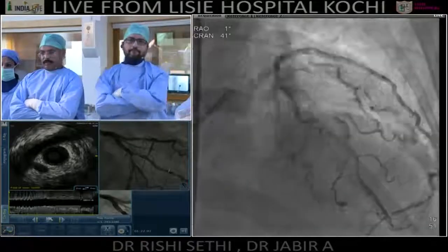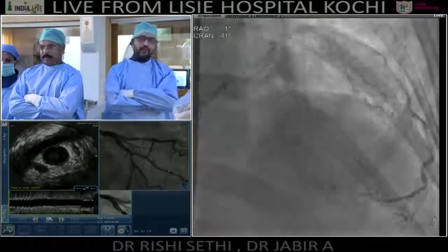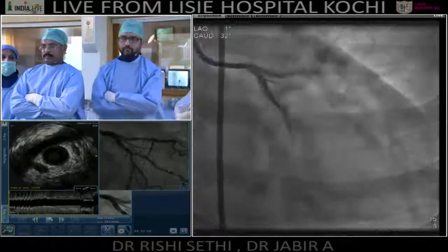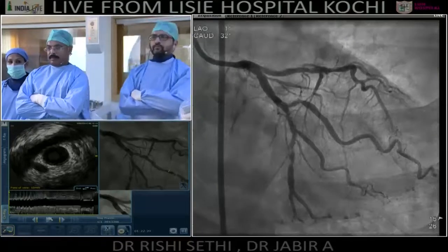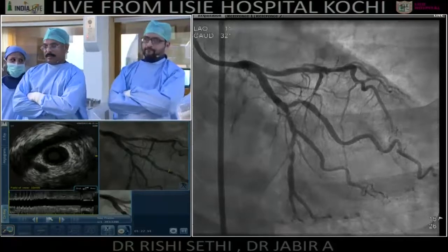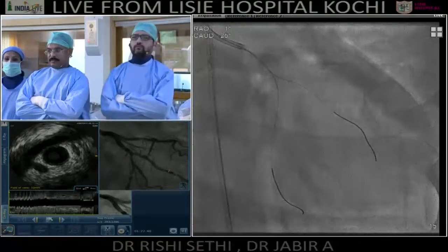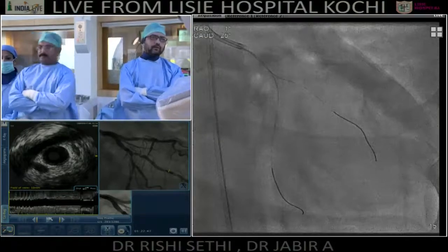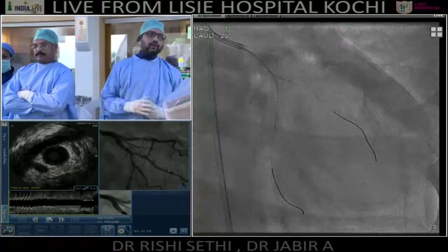So this patient has multiple lesions. Patient is hemodynamically stable, no? Ideally, the infarct-related vessel first, followed by the staged procedure 2 to 3 days later. But nowadays, some people do preventive PCI as well, also in our country. Particularly, I personally have been doing preventive PCI for the last 1 year. In the same setting, I dilate and put the stent in three regions. So there is no difference. In the studies of preventive PCI, there is no significant difference in MACE, MI and stroke. The statistics show, if I do staged procedures, MACE is 6.8.